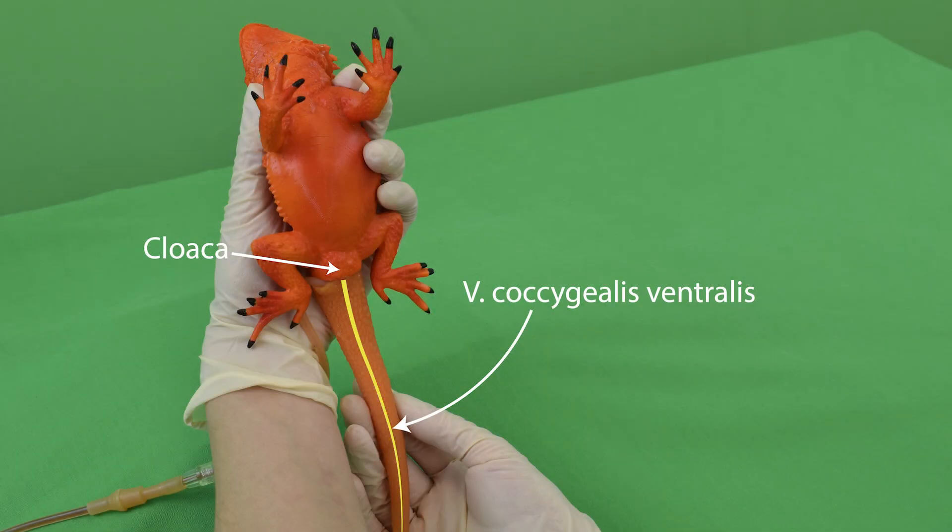When it comes to bearded dragons, the ventral coccygeal vein — vena coccygialis ventralis — is to be used for extracting a blood sample. The ventral coccygeal vein can be found distal to the cloaca, along the ventral midline of the tail vertebrae.